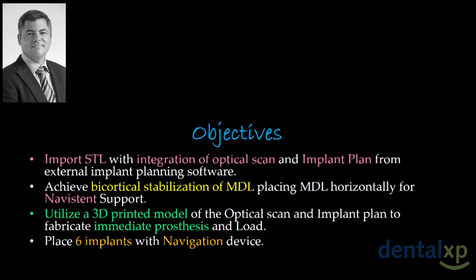Why? Because if you take a scan and you place some implants in a scan and you add in that implant planning software some abutments, you can now export that data, print that data, and you can have your technology fabricate a prosthesis for you, utilizing the standard articulator mount technology.